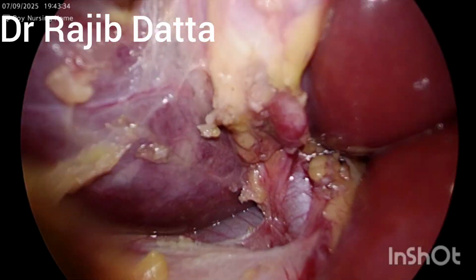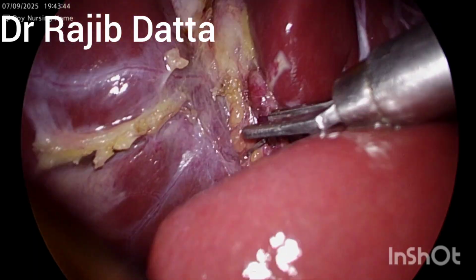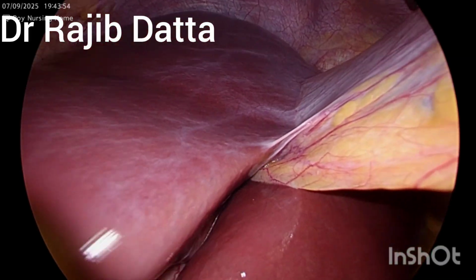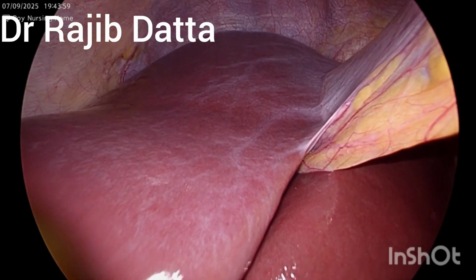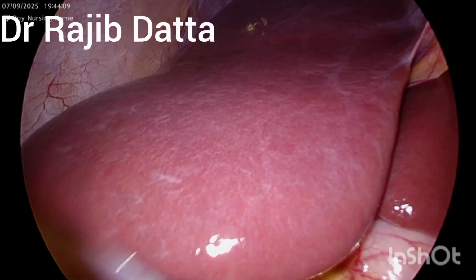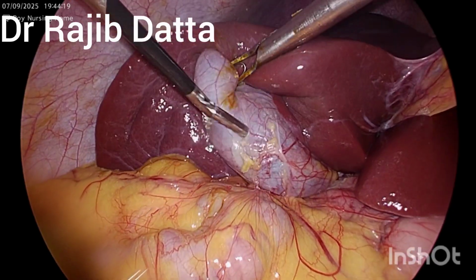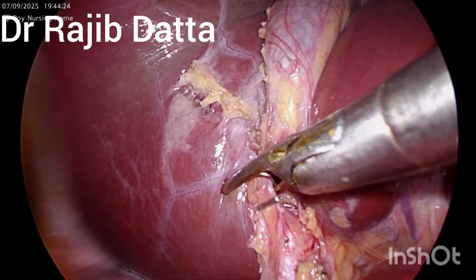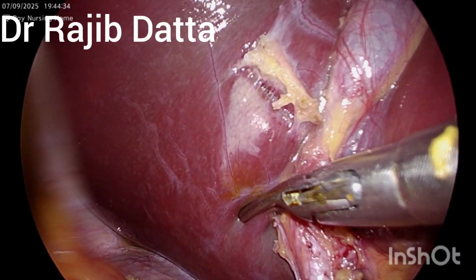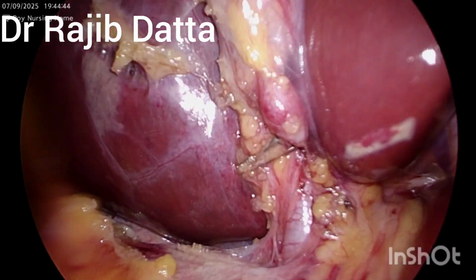So again we are going to use the 400 Liga clip just distal to this previous one, so that the proper end to end or edge to edge coverage of the circumference of the cystic duct can be achieved with the help of this 400 Liga clip that has been applied just distal to the previous clip. So it is now well appreciated that it is properly applied here.